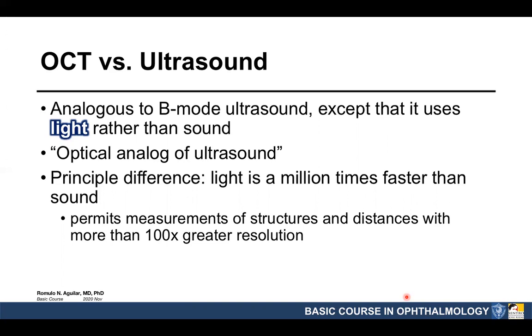Now, the principal difference between an OCT and ultrasound is that light is a million times faster, or it travels much, much faster than sound. Thereby, when you use light, the images that you produce would have much better resolution than when you use sound.